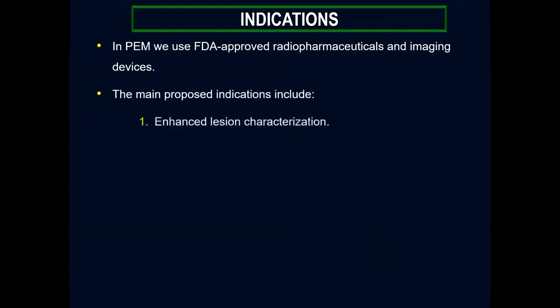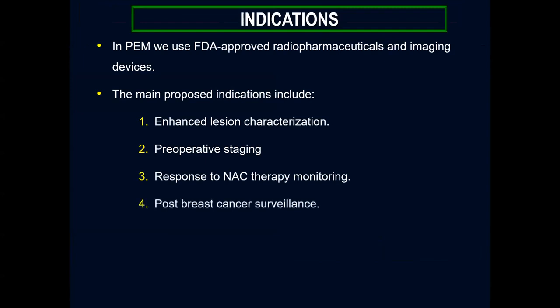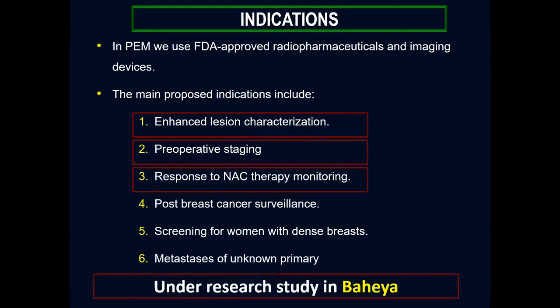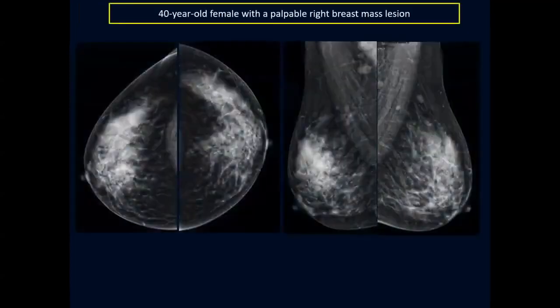The main proposed indications include enhanced lesion characterization, preoperative staging. We use it to assess the response to neoadjuvant chemotherapy, in post-breast cancer surveillance, for screening women with dense breasts, and for metastasis of unknown origin. And three of these points are under research in Baheya Hospital.